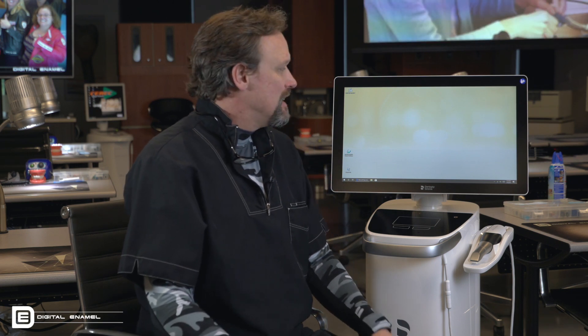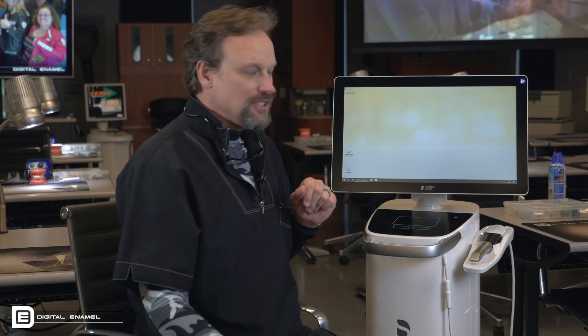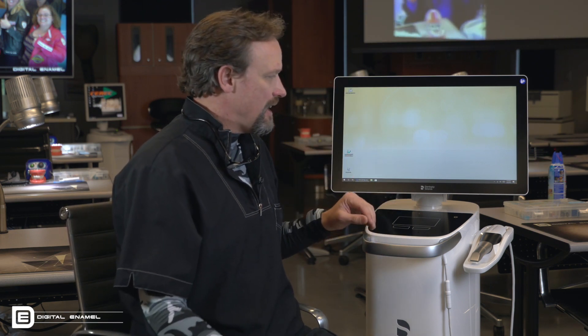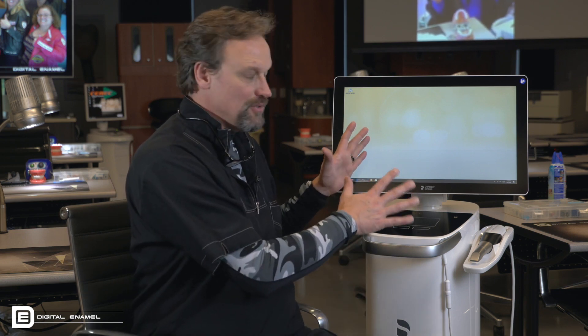Hey Todd Erlich, I just want to show you a little bit more on the new CEREC 5.0 software and the new PrimeScan scanner. So the new CEREC system has a touch screen and a trackpad — you can use either or both.